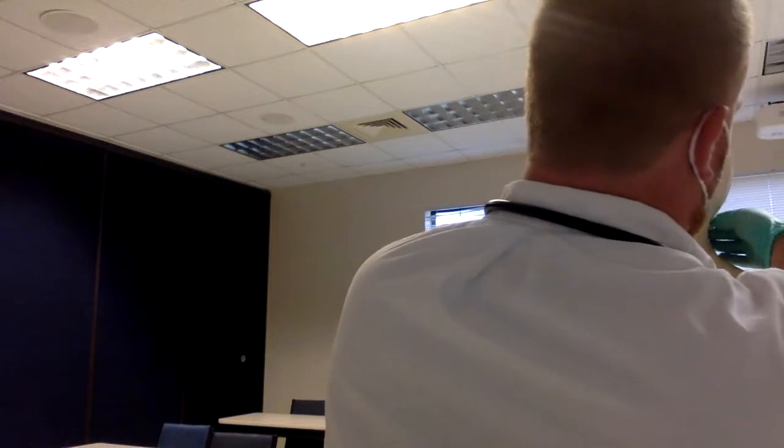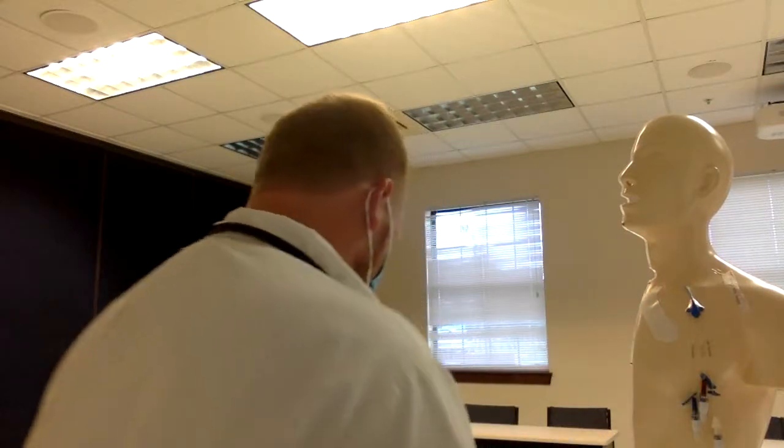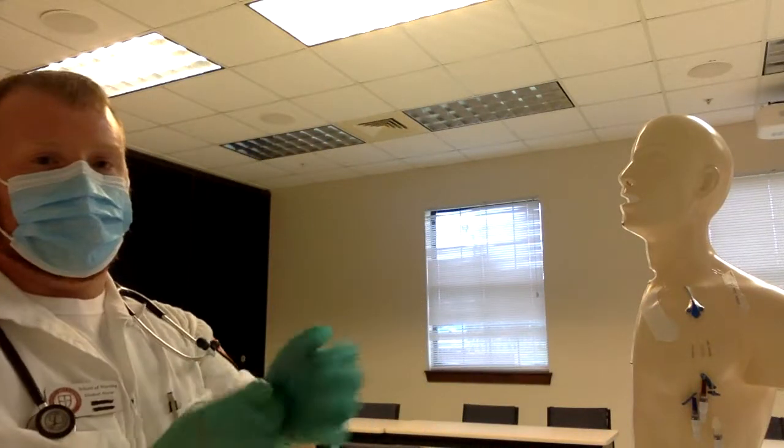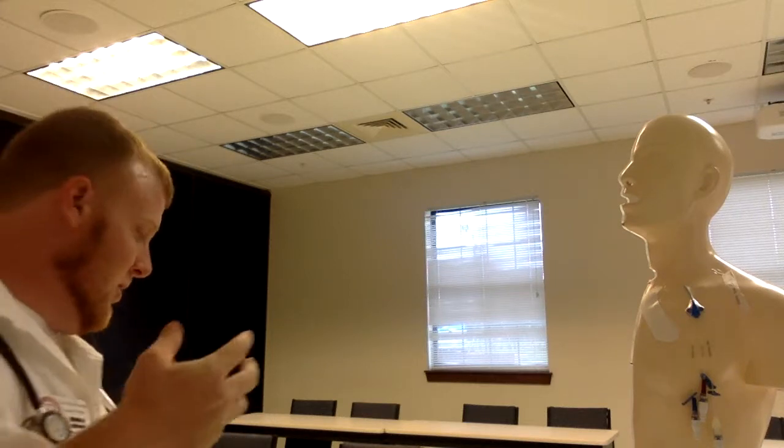You can take your patient's mask off of them now. You can take your gloves and your stuff off. But throughout this whole thing, make sure to note any redness, swelling, tenderness, discharge, anything like that, and document it in the patient's chart. The upkeep, flushing these lines, is really important. Like I said, if you go to use it and it's there but it's occluded, it's no good. So make sure and do that every shift.